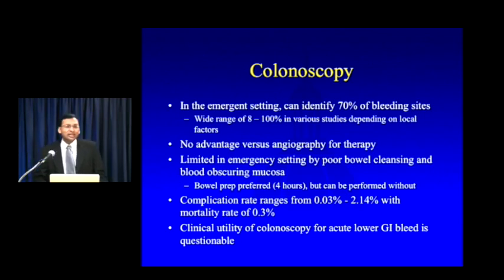And so at the end of the day, the sensitivities and specificities reported in the literature are far lower in practicality in the acute ER setting.